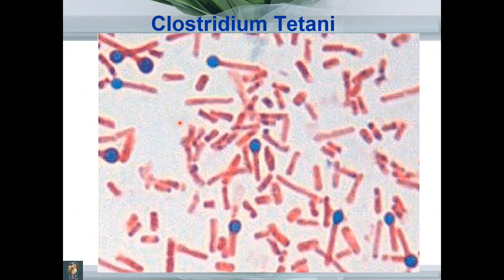This is the diagnostic slide of a very dangerous bacterium — Clostridium tetani, another gram-positive rod. You can appreciate the rod-like structure. You can also appreciate a terminal round swelling, giving it a tennis racket-shaped appearance. This tennis-racket-shaped organism is Clostridium tetani, known to cause the very dangerous and fatal disease tetanus.